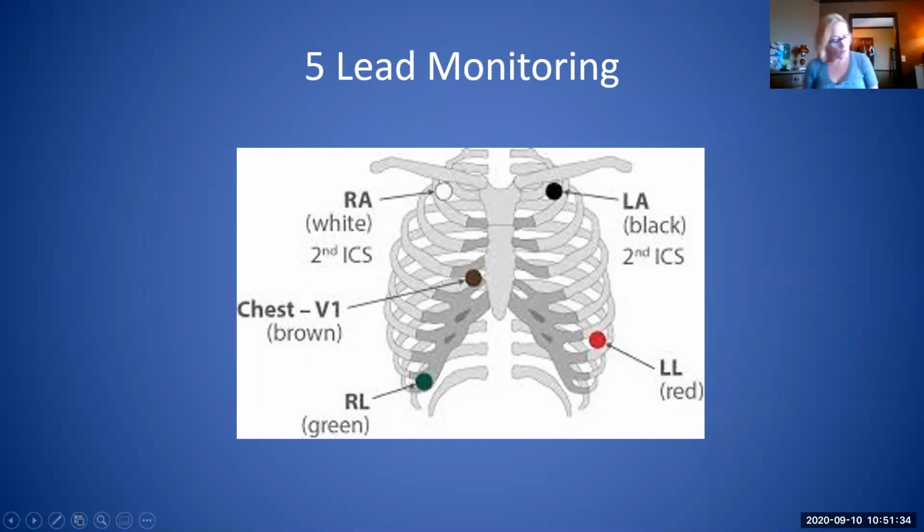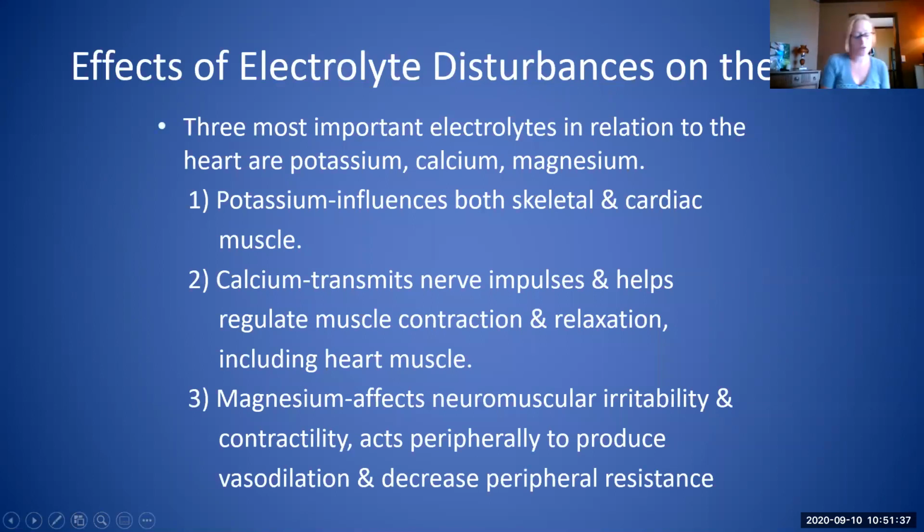So, the effects of electrolyte disturbances. Oh, and I forgot to mention, whenever you're placing your leads, one big thing that can cause a lot of ectopy is hair. So if a patient is real hairy, hopefully it's a man, you might need to shave them first before placing the leads, because if you place it over hair, it is just not going to pick up, and it's just going to look like a bunch of artifact, and it doesn't read accurately. So you really want to make sure that you're prepping the skin adequately before you put those patches on and that they're staying on. Or if they're real sweaty and diaphoretic, you might need to make sure they're dried off first before you place those leads.